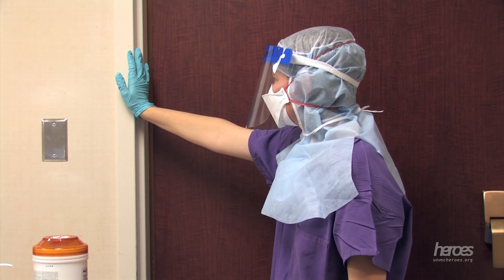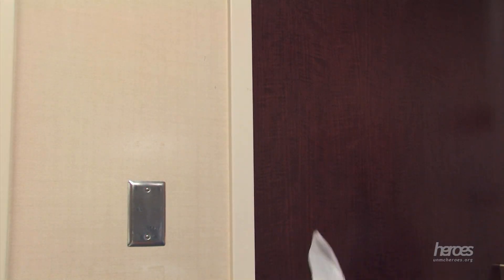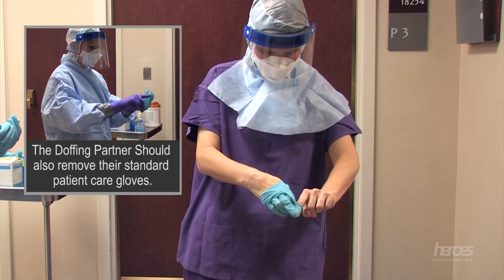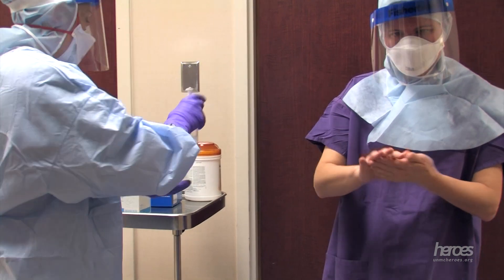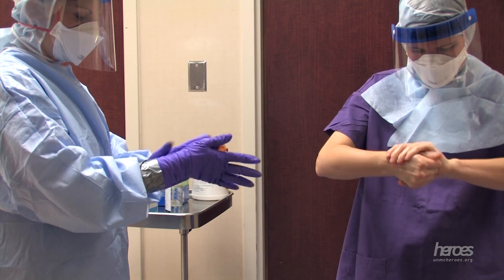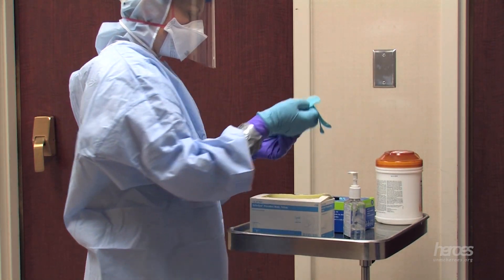The doffer can put a hand on the patient room door frame to assist with balance. If used, the door frame area should later be cleaned with a bleach wipe by the doffing partner. Remove the inner standard patient care gloves using glove-in-glove technique and gently place them in the trash. The doffer and doffing partner should now perform hand hygiene but not leave the doffing pad. Before any additional PPE is removed, the doffer should apply new clean gloves provided by the doffing partner. The doffing partner should then also don a clean pair of gloves.